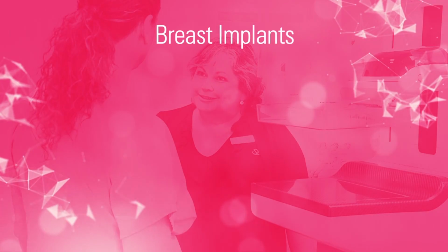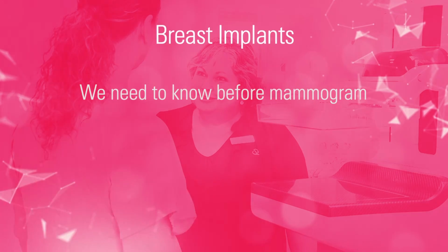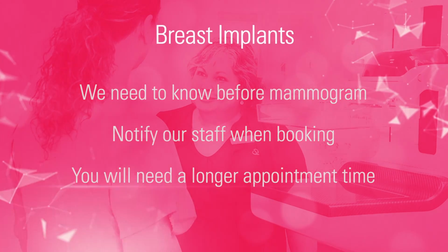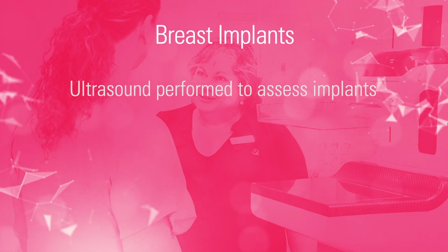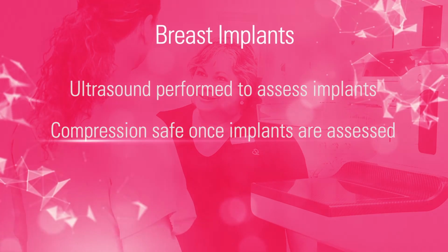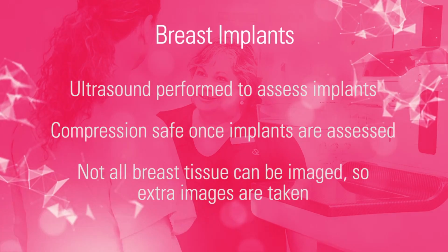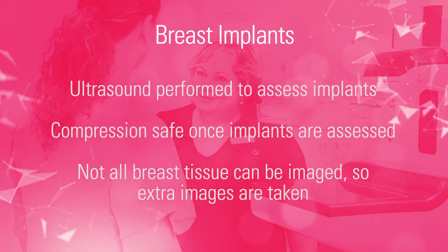If you do have breast implants, it's best we know this before your mammogram. Your mammographer will ask you when you arrive, but we prefer you notify our staff when you make your booking, as you will need a slightly longer appointment time. We usually perform a short ultrasound before your mammogram to assess the implants before we apply compression. It is perfectly safe to apply compression to implants once they have been assessed. Unfortunately, with implants, not all breast tissue can be imaged, so we may take a few extra images to make sure we can assess all the tissue.